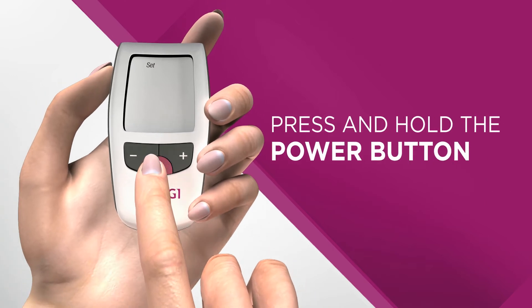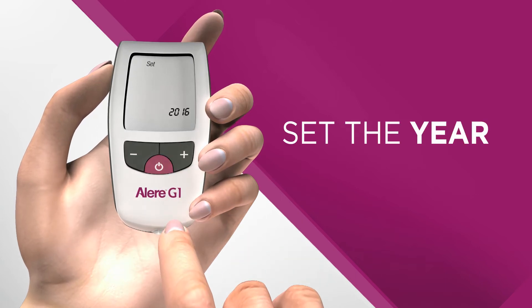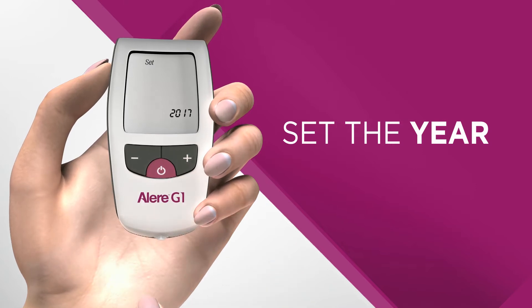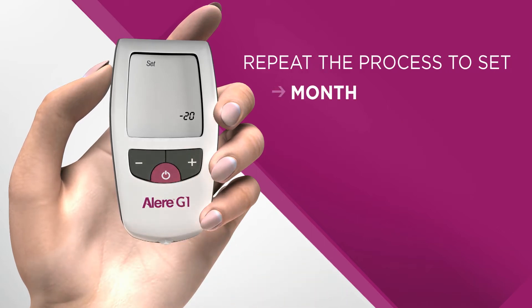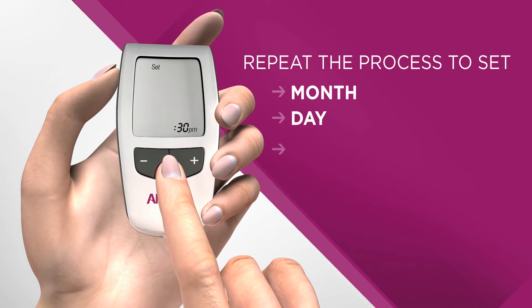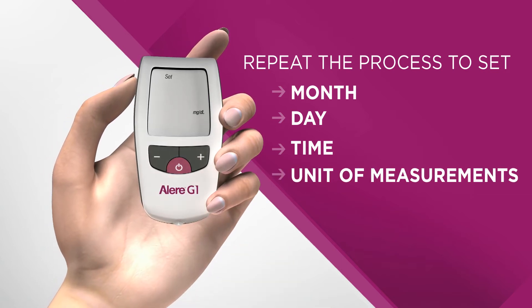The year will flash. You can use the plus or minus buttons to adjust the year. Once the correct year is displayed, press and release the power button to save. The monitor will advance to the month setting. Use the plus or minus buttons to set the month. Now follow the same process to set the day, hours, minutes, time format, alarm, and so on. Set the unit of measurement to milligrams per deciliter.